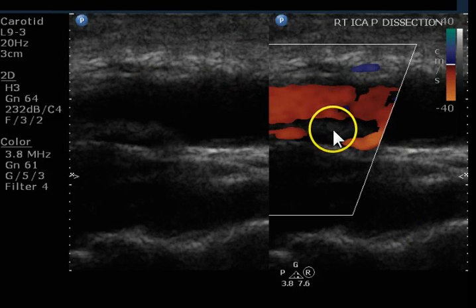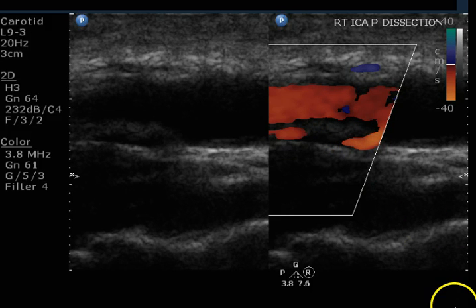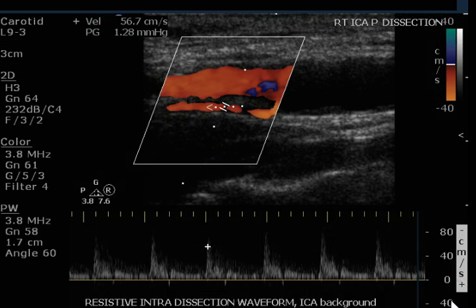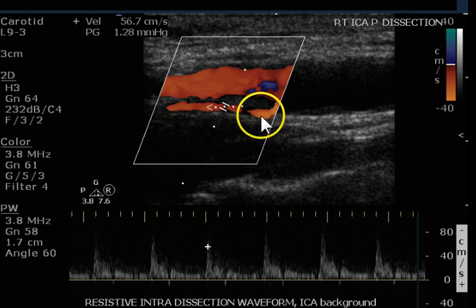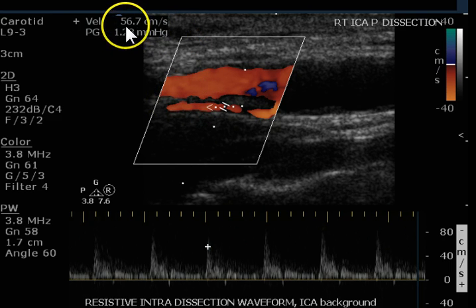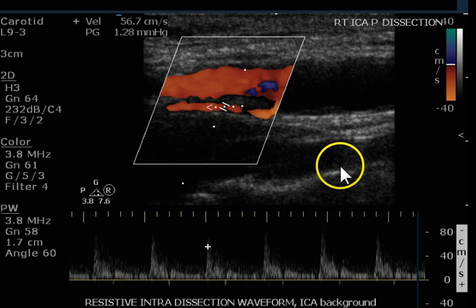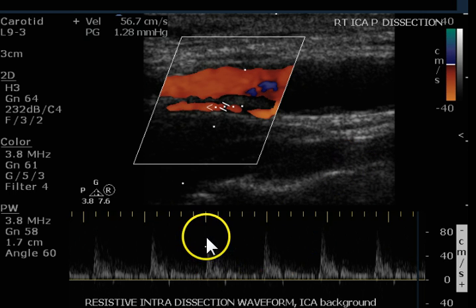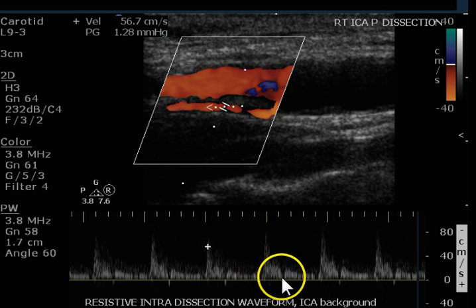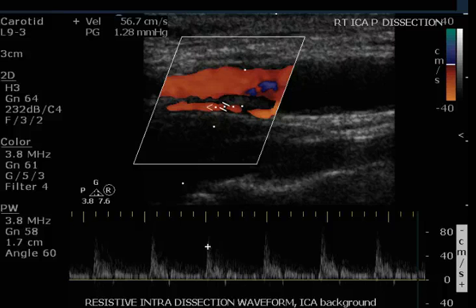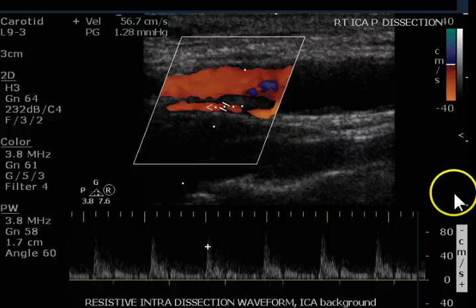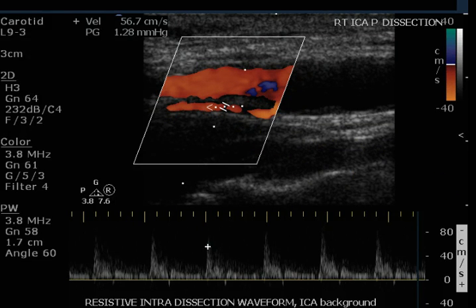Here we have some more of the flap — it's markedly thickened in this area. Now we've got the false lumen. The steering here is coming toward the top of the screen; it would have been much better to steer the color in the opposite direction, but still a reasonable image. This looks a lot like an ECA, and sometimes these get confused with the external carotid artery. The reason is there's higher resistance — there's probably only a small defect distally allowing this blood to enter the true lumen.